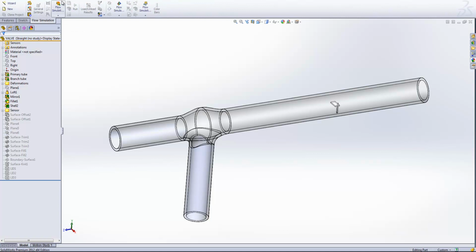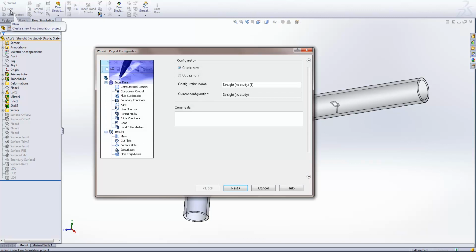You'll see I've got a flow simulation tab up the top here, and that really is a sign of how easily flow simulation integrates with our SolidWorks standard user interface. If I select the wizard here, we jump in and start creating our study. So first of all, we're going to choose what configuration we're going to use. You'll see later that I've got a number of configurations that I'm going to run the study on and try and optimize my design, and therefore I'm going to insert the study into the same configuration that I'm in now.